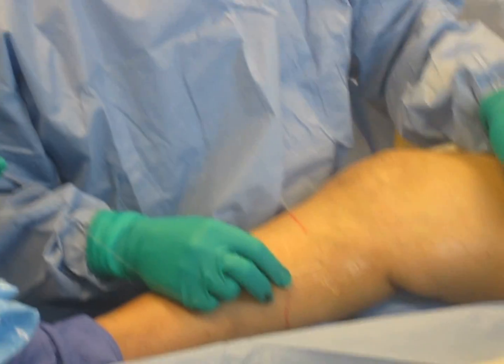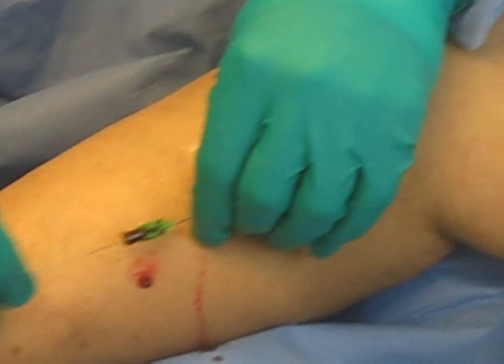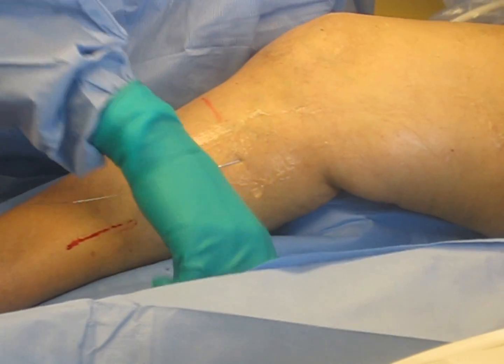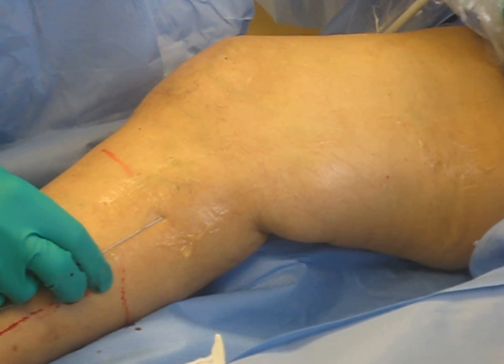What we've done here is we've run our guide wire up the vein — we're going to take that all the way to the top. On our screen, we can see the guide wire, which is now inside the vein — that little round circle, that little bright spot there. We're going to bring it down to where the superficial vein goes into the deep vein.